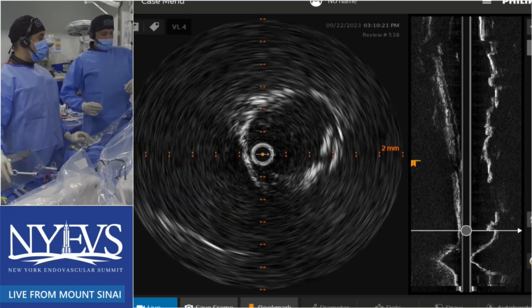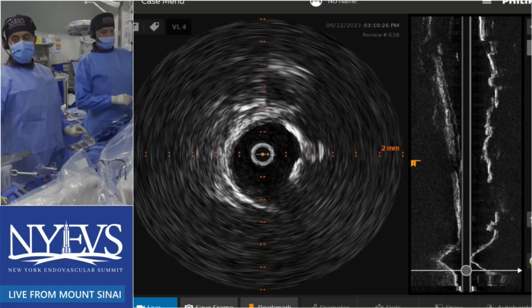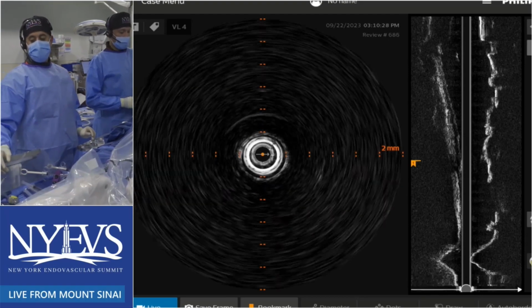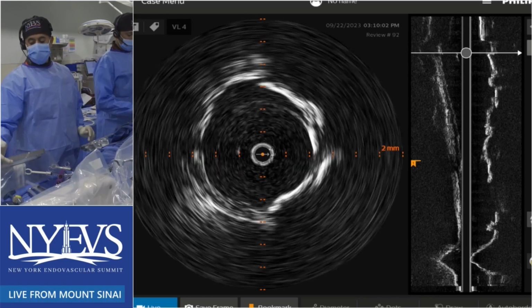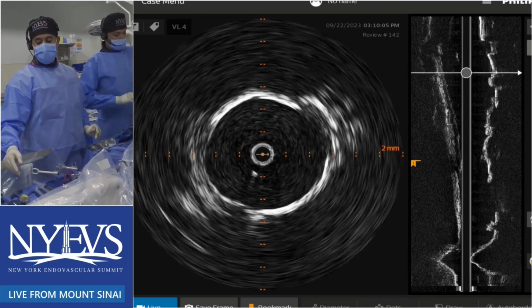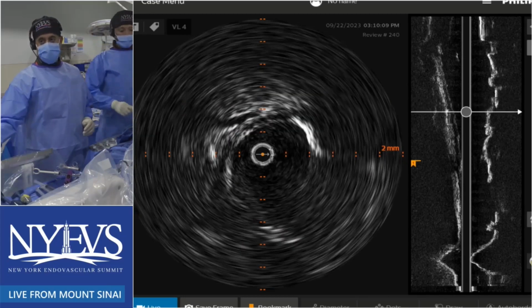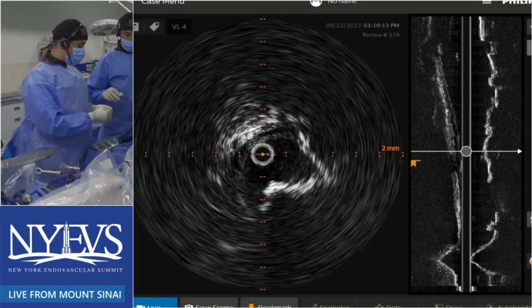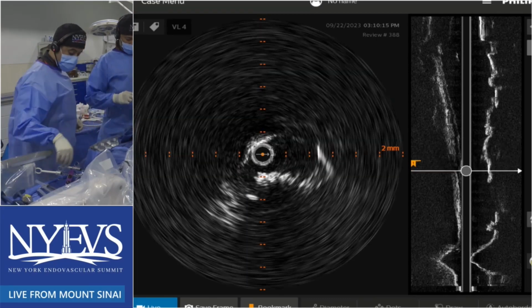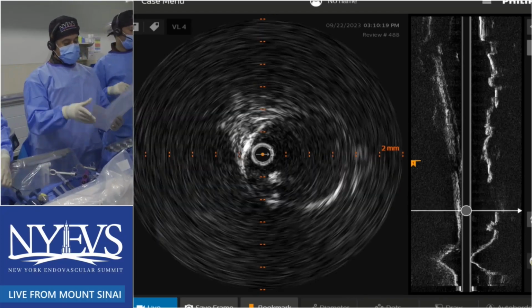In fact, Sean Lyden at Cleveland, we for a long time were proponents of using uncovered stents for pretty much everything. I'd kind of switched after I'd left there based on the late COBEST data, but they published some data, and it's not randomized, but it's very good patency on uncovered stents for almost everything they use for very complex aortoiliac disease. And I feel like I have the same thing. I think the issue is getting adequate expansion. And I think that's key.